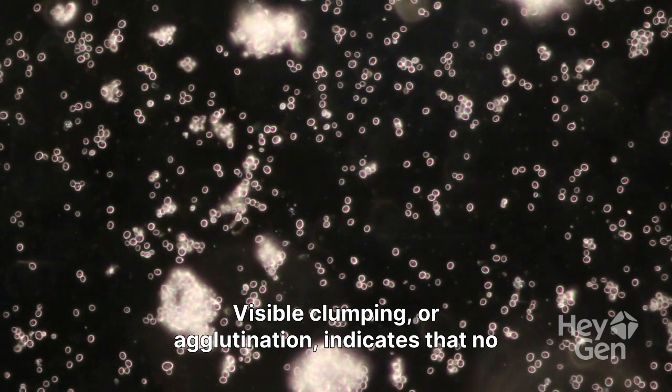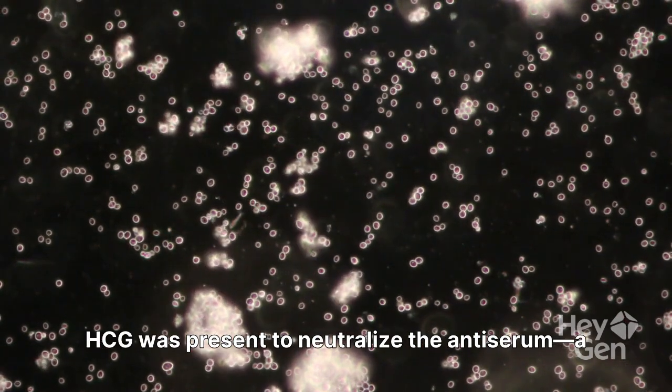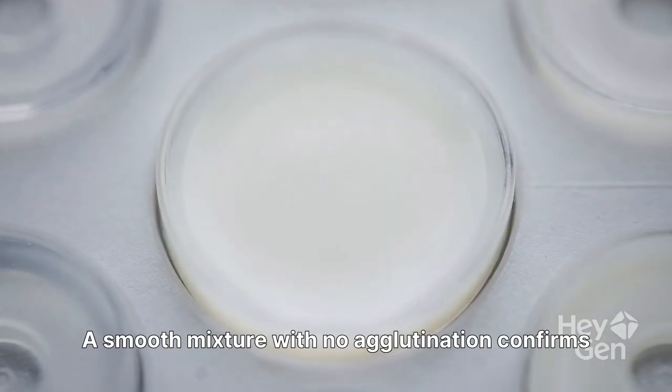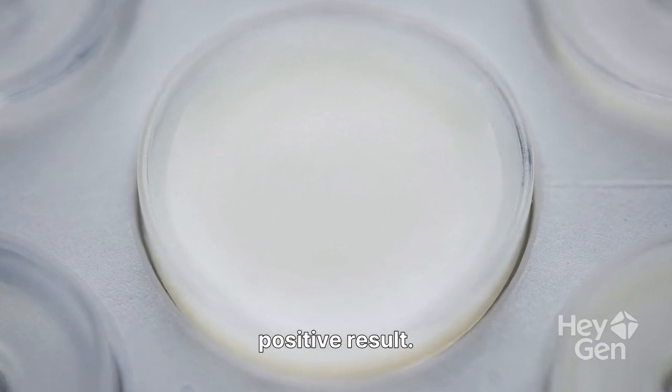Visible clumping or agglutination indicates that no HCG was present to neutralize the antiserum, a negative result. A smooth mixture with no agglutination confirms that HCG was present in the sample, a positive result.